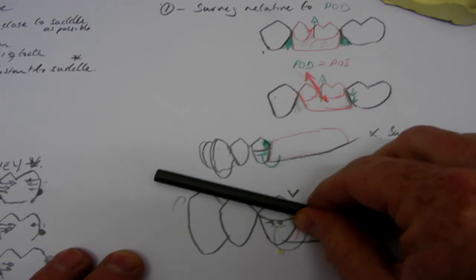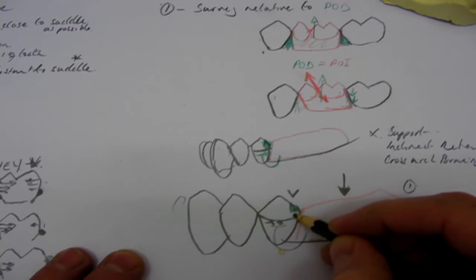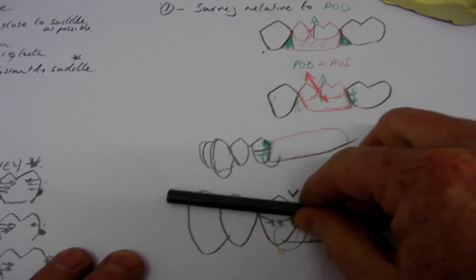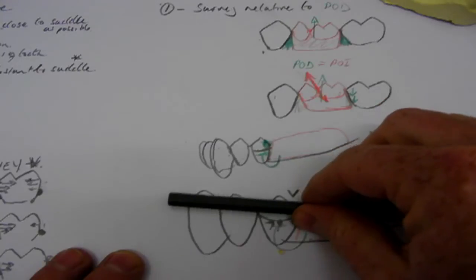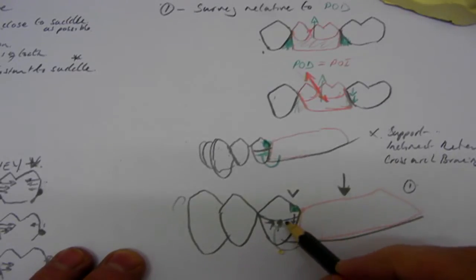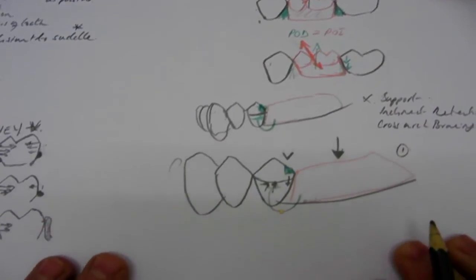So we get this wrenching action on the abutment tooth, and it's aggravated by the fact that the load is being transmitted down the distal aspect of the tooth as well. So you're getting load down the distal aspect. The whole thing's rotating around that occlusal rest. The clasp tip is engaging in that undercut and exaggerating this, or contributing to this rotational force on the tooth. And this is considered destructive and causes abutment teeth to displace.